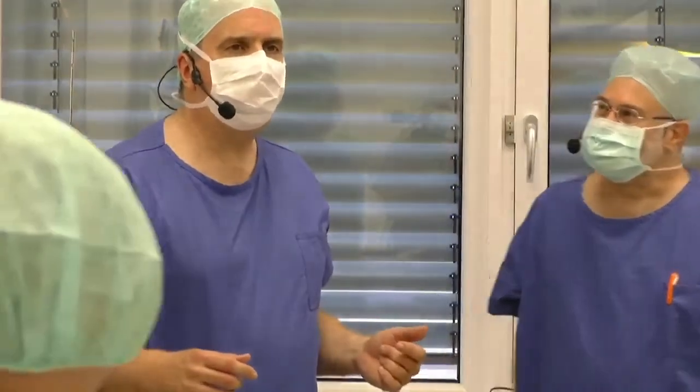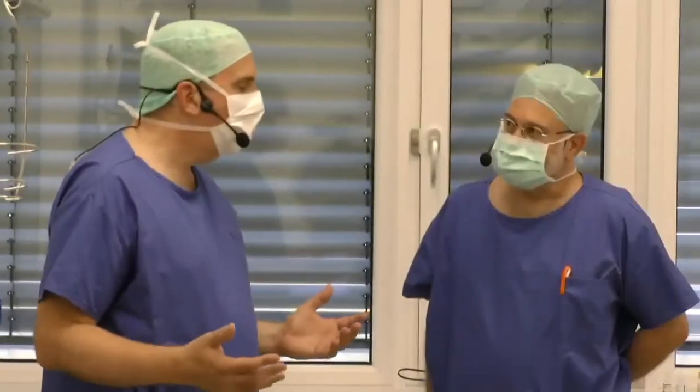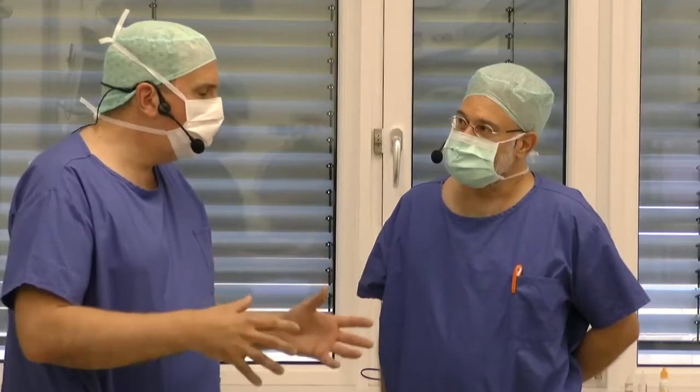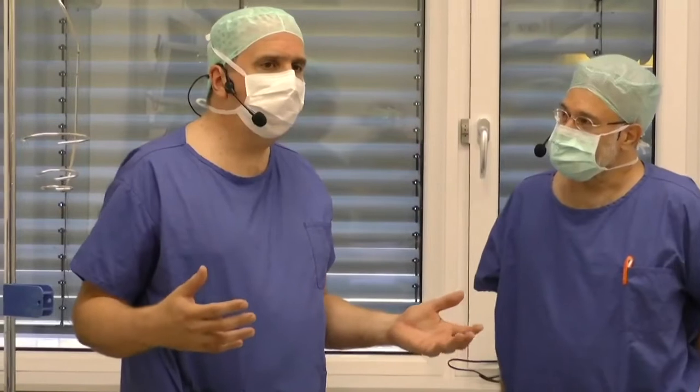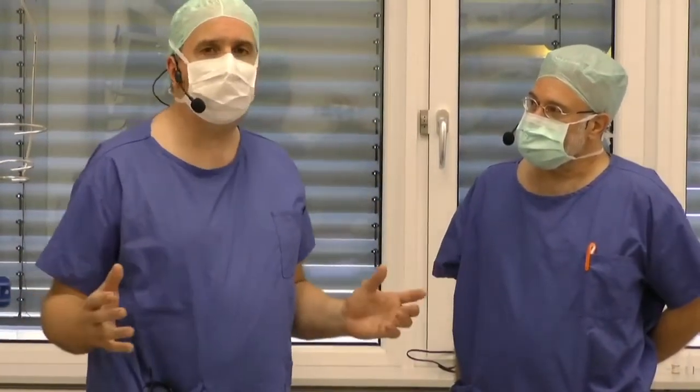I don't think I was the first to implant the add-on IOL, but I think among the first 10 who did it, and it was 10 years ago. This Liberty system is called Liberty, and I like the name because you have the liberty to adapt your lens system to the visual and the refractive needs of the patient. For example, if you have patients unsatisfied with the visual acuity, or patients who say, okay, you told me the side effects of the multifocality, but I cannot deal with it.